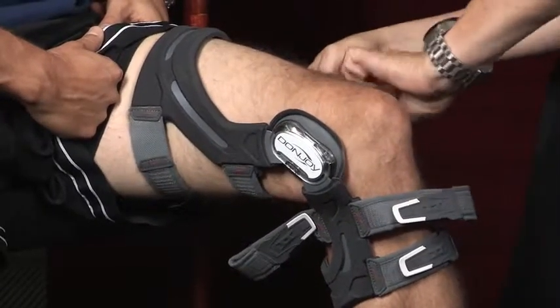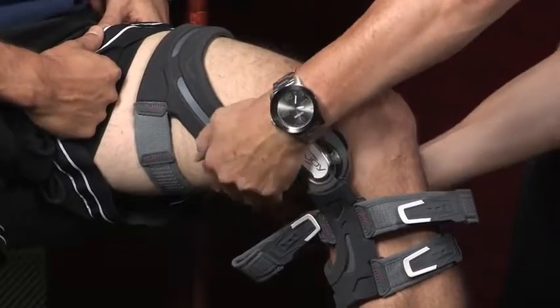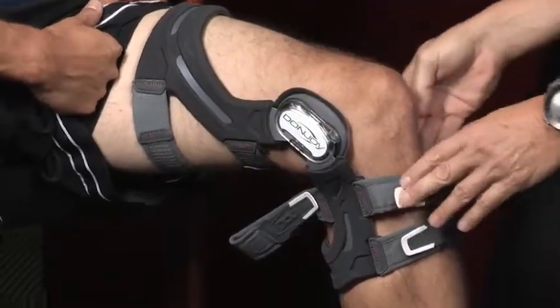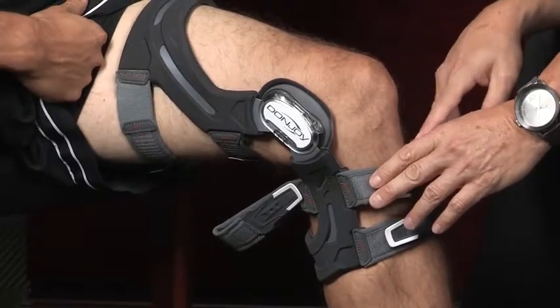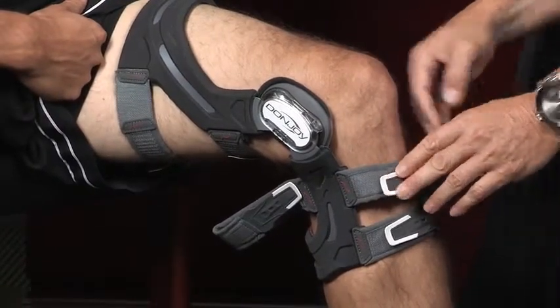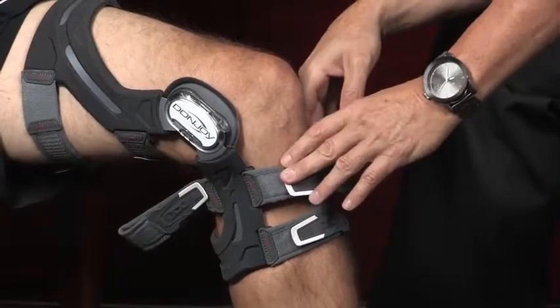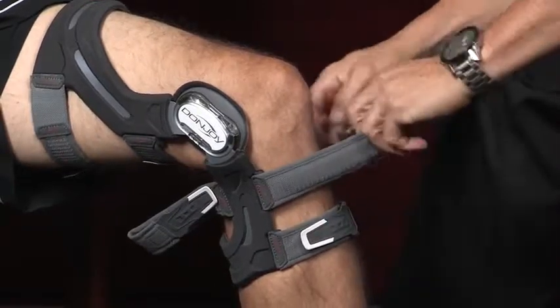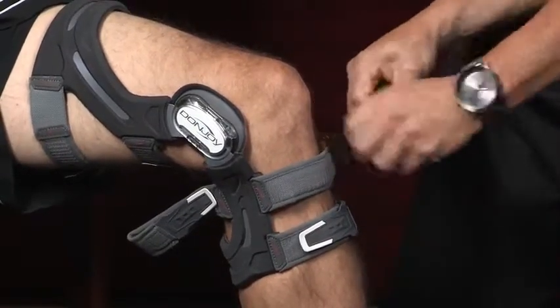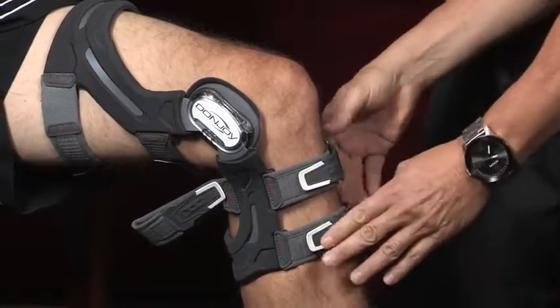Put that through — fits all right so far? Good. The number four strap, which is right here, is the most important strap of the brace. This is what puts the force on your tibia to keep it from moving forward, and that's really the critical part about protecting your ACL, whether it's been injured or you're trying to prevent injury. That settles right there.